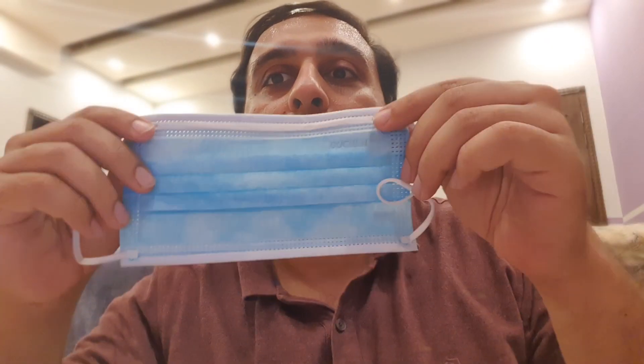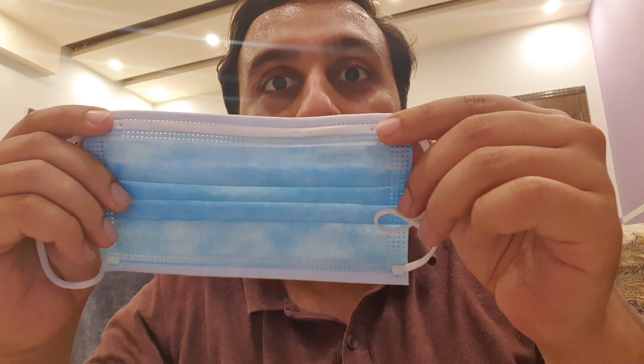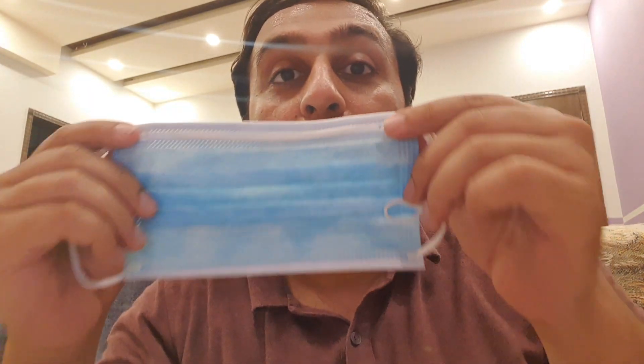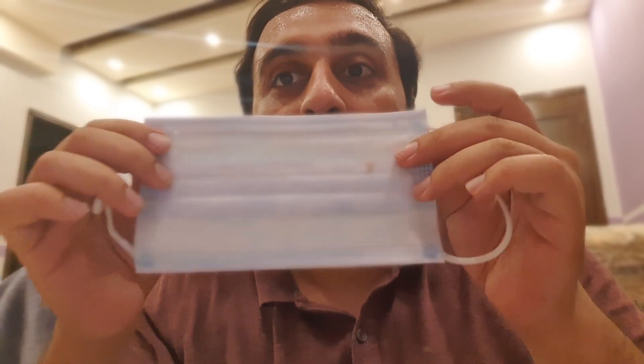Hello everyone, hope you're doing well. Let's settle it once and for all — the correct way to wear a surgical or medical mask. When you get a good quality surgical or medical mask, it has two sides: the colored side, which may be blue or green, and it is the hydrophobic side; and the white side, which is the absorbent side.